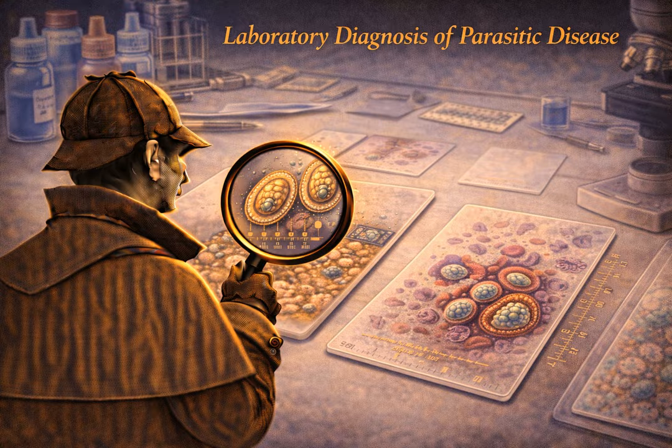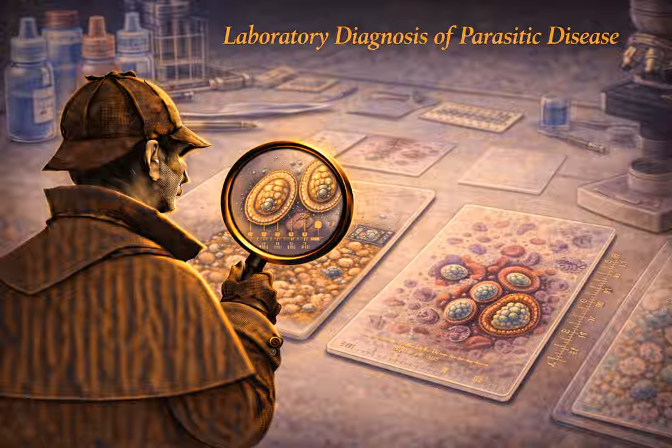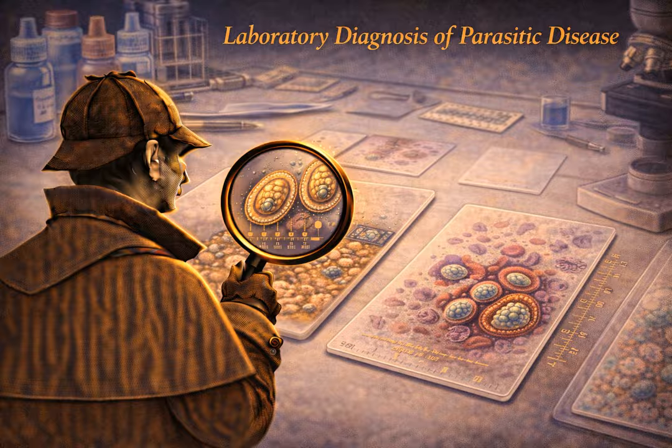The absorbent nylon string soaks up the local duodenal mucus. And because parasites like Giardia live right in that mucus layer, they get physically stuck in the mesh of the string. Then, and this is definitely the unpleasant part, the clinician slowly pulls the entire string back up through the mouth. Oh, wow. Yeah, that sounds horrible. It's not great. You pull it out, and then using gloved fingers, you physically strip the bile-stained mucus off the bottom end of the string right onto a glass slide and look at it under the scope. It is a highly effective way to directly sample the deep small intestine without having to schedule an invasive upper endoscopy. But as you can probably imagine, patient enthusiasm for swallowing a string is generally quite low. I can vividly imagine that.